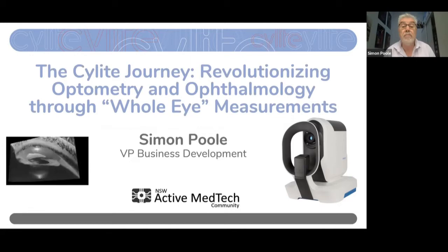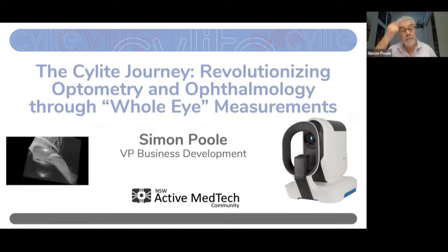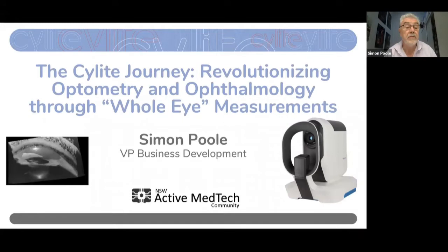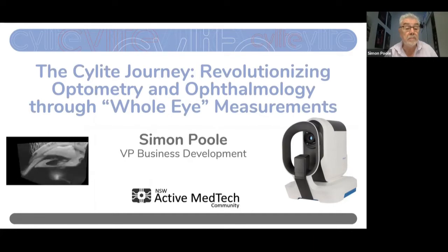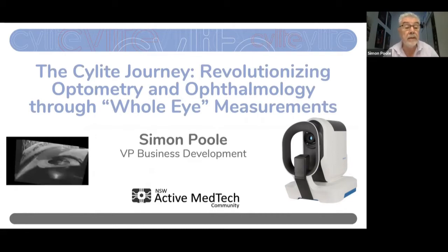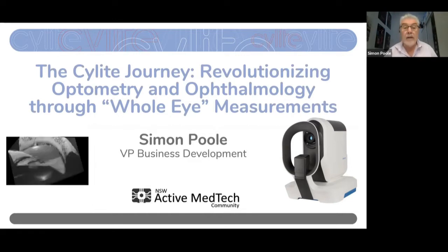You'll see a few of these through the presentation, and that is basically a three-dimensional picture of an eye. So you can see as it spins around, you've got the eyelashes at the top, the cornea at the front, the iris, and the bit through the center of the iris, the pupil, and at the back of the pupil there is what is called a starburst cataract. So that's the sort of diagnostic tools that we are developing.